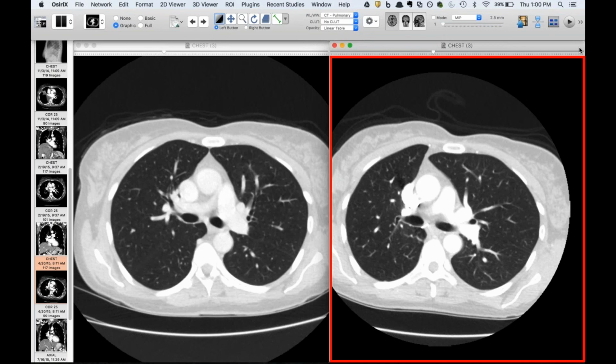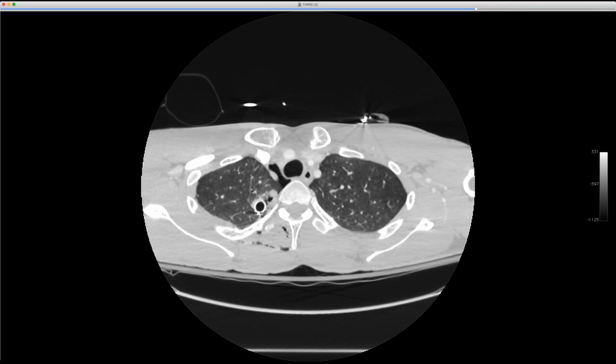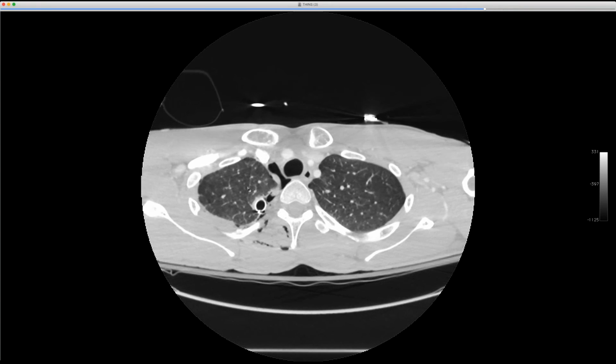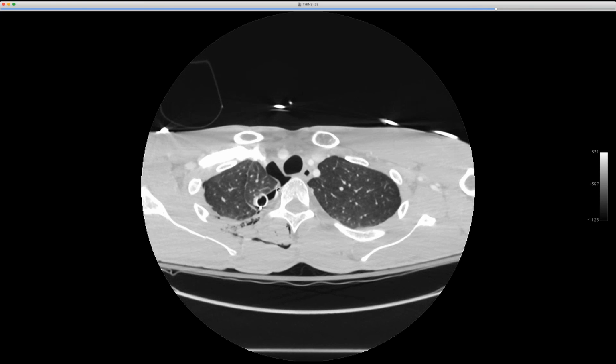So that's great. Looking at the thinness or thickness of the fissure may help as well. If it's really thin, then you wonder that it's lost the 2 layers because it popped out. Oh. Yeah. I'll go back and look at mine again. Yeah, the one I showed you guys, let me pull it up here, has a very thin fissure. Let's see. Yeah, you see how thin that fissure is. Looks like a typical fissure of 2 layers of pleura. Unfortunately, I don't have a pre-trauma on this guy, but yeah, this one was traumatic. You don't really see the mesoazygous except on the coronal, that little tethering of it.